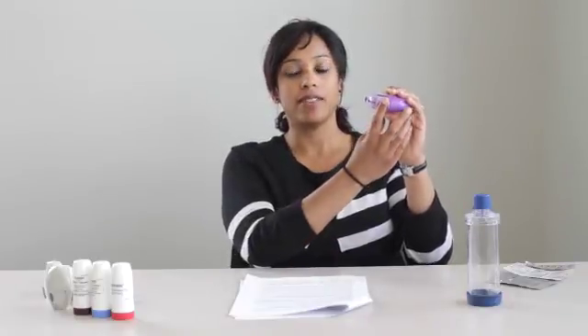When you are done with the discus, place your finger in the thumb grip and pull towards you all the way until it clicks.